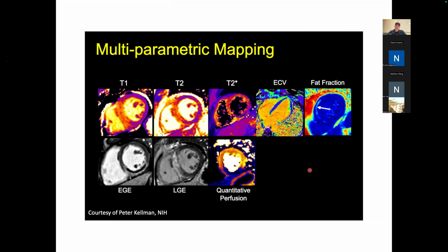And as I said, early on in MRI, we all thought we'd be measuring these time constants every day. And that turned out to be harder than it was worth, right? It was better to spend your time averaging an image that was proportional to T1 or T2, but wasn't what you needed to invert the signal to get the actual value. But that's changed now.